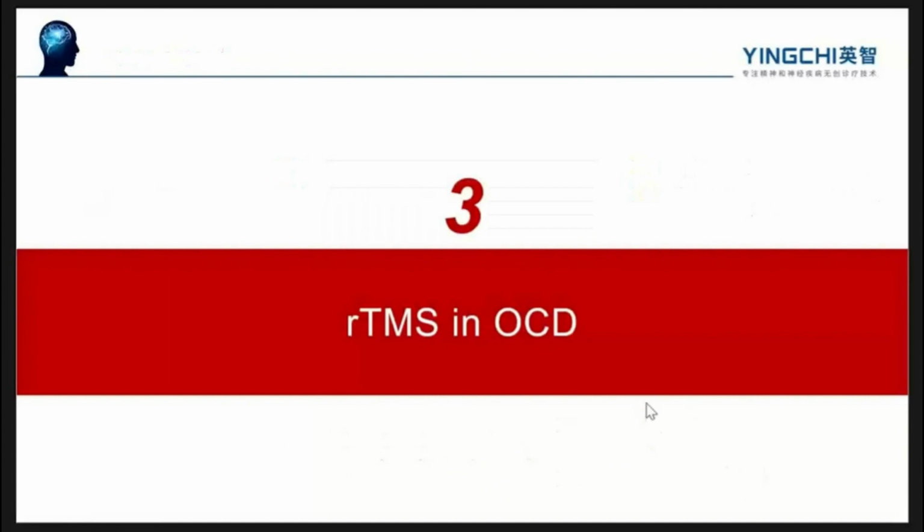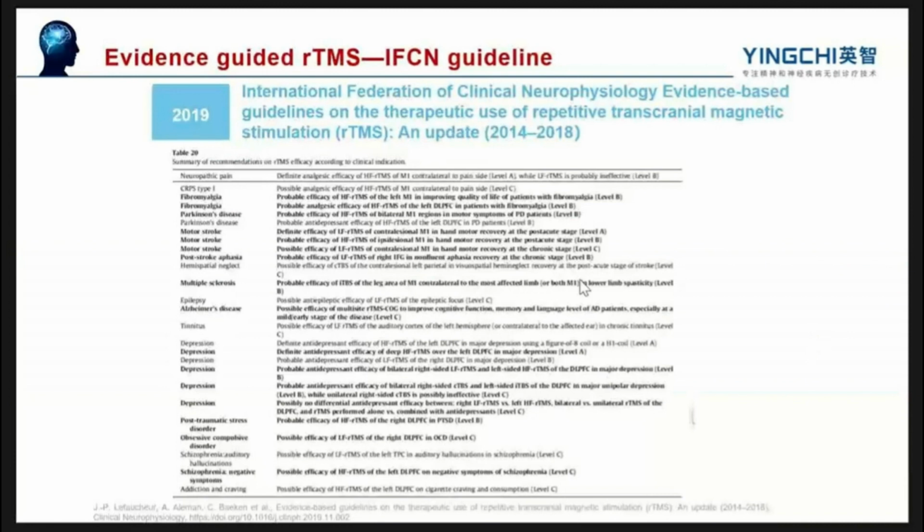And next, we will introduce the specific treatment strategies by using TMS in treating OCD patients. Since the birth of the rTMS technique in 1985, this technique has been widely validated in clinical researches. And this is a guideline published by the International Federation of Clinical Neurophysiology. And they also update the guideline every 4 years. And this is the newest guideline.